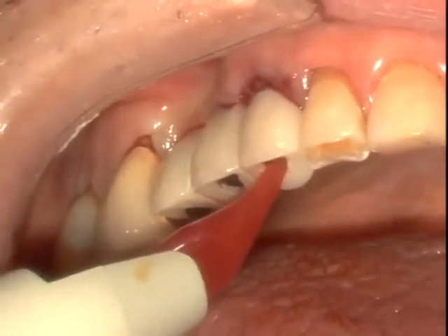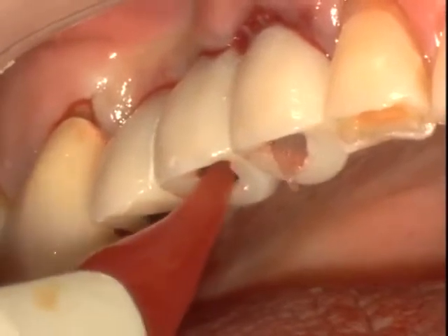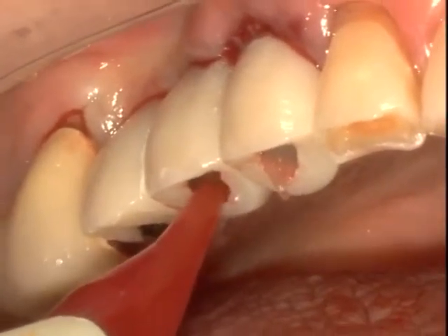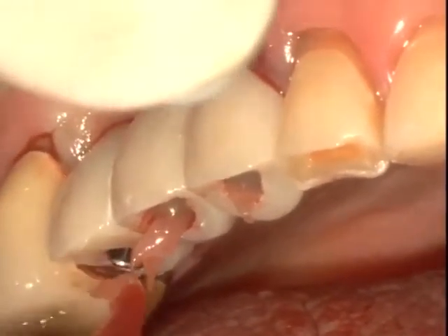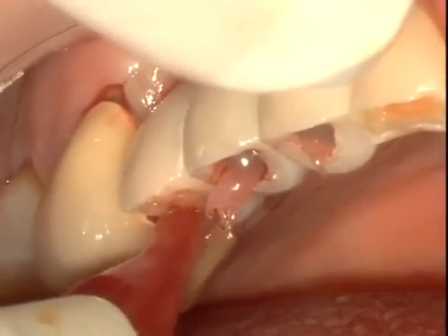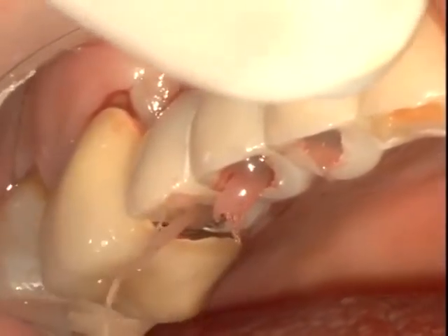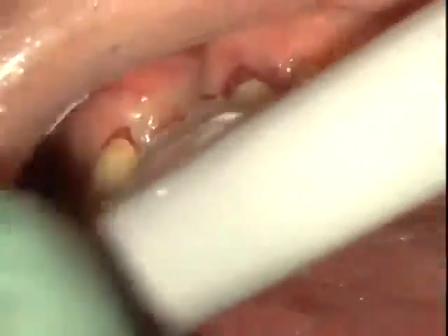Sealing material is placed. Again, this could be flowable resin or Fermit, or you can use Barricade. In this case, Barricade, which is a light cured periodontal dressing, is utilized as it's easy to place, it's inexpensive, and is easy to regain access to this area. You can usually use a wet finger with a little bit of alcohol on the finger and then light cure it in place as you see here.